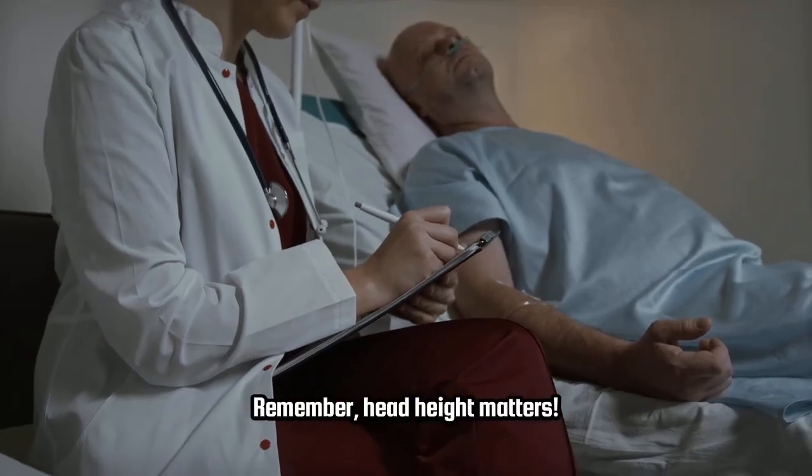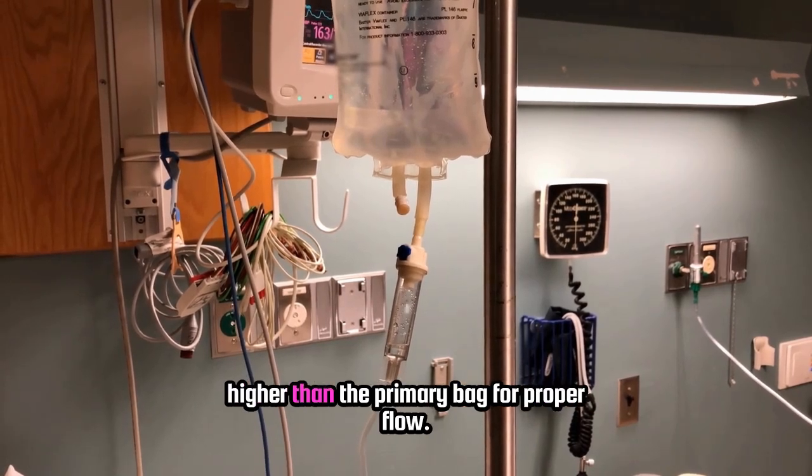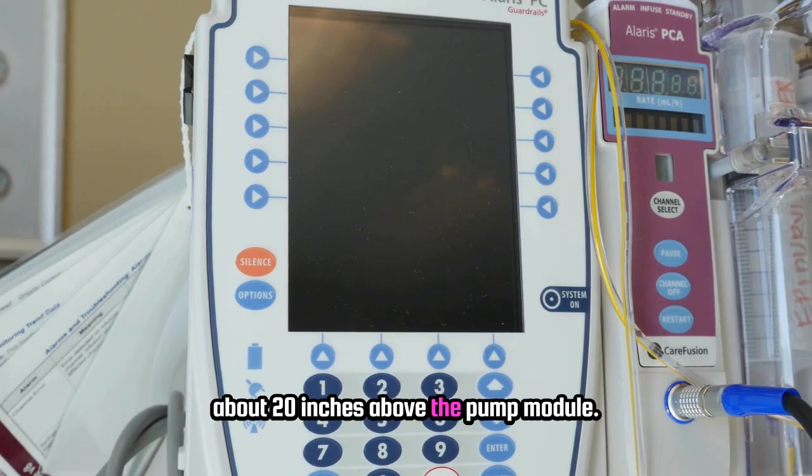Remember, head height matters. Hang the secondary bag at least 9.5 inches higher than the primary bag for proper flow. For Alaris pumps, both bags should ideally be about 20 inches above the pump module.